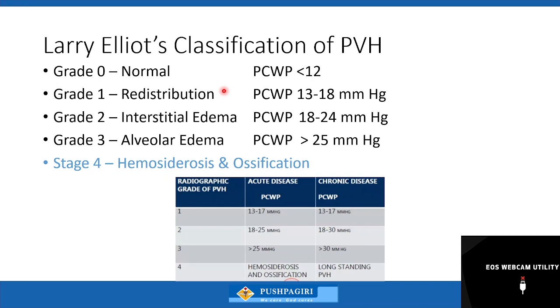The same thing. This stimulates vasoconstriction because of hypoxia, since the ventilation and gas exchange are affected, and also obliteration of the vessels, long-standing vessel fibrosis. So the whole lung tissue has fibrosis. The lower vessels are lost, so the upper lobe vessels compensate. That is why you get redistribution. That's the earliest sign.